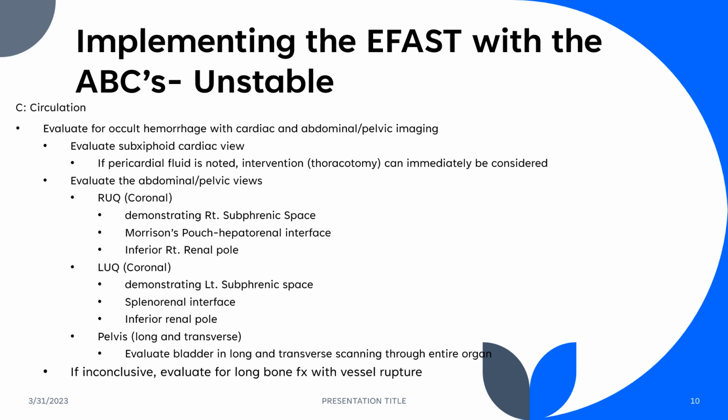And in the pelvis, some people will choose to look at the paracolic gutters, as those are potential retroperitoneal or extraperitoneal spaces. Others will go directly to the bladder and evaluate that bladder completely in long and transverse.